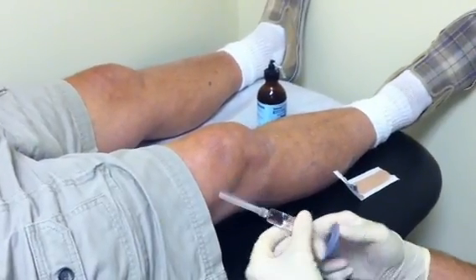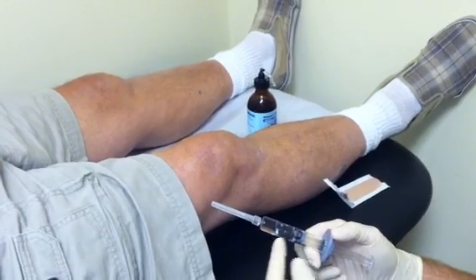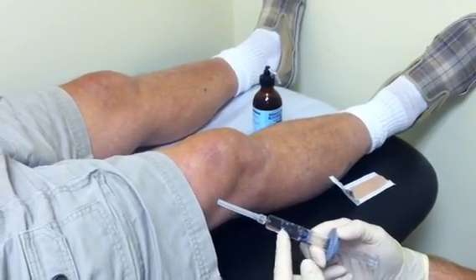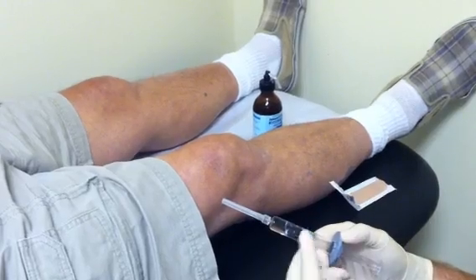This is an example of a Synvisc injection, and this is a Synvisc One. This is where we give just one syringe full. We do it one time — other preparations can be done three or five times.